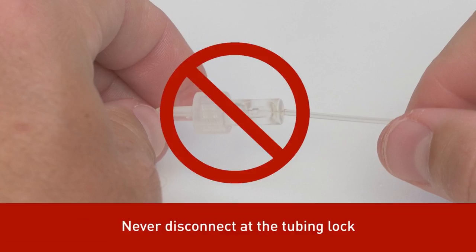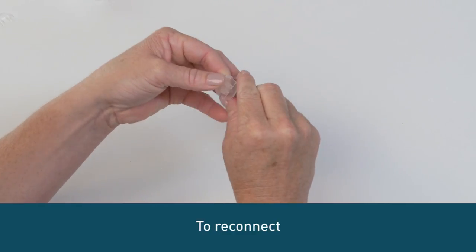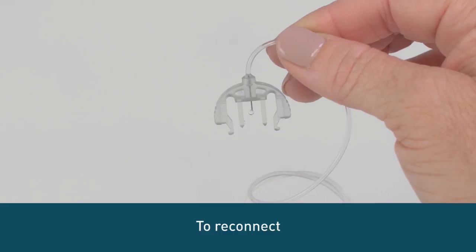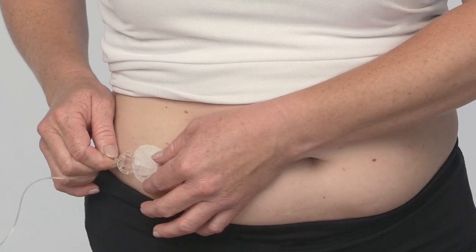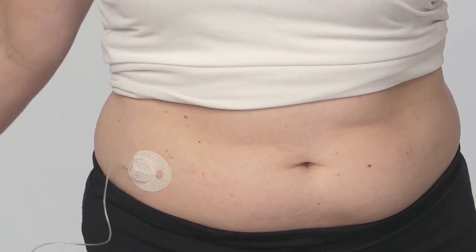Never disconnect at the tubing lock. To reconnect, remove the circular protective cap. With the needle pointing down, fill the tubing until you see insulin drip from the connector needle. Now, remove the cover from the cannula housing. Place your finger in front of the cannula housing and push the connector needle straight in until you hear a click.